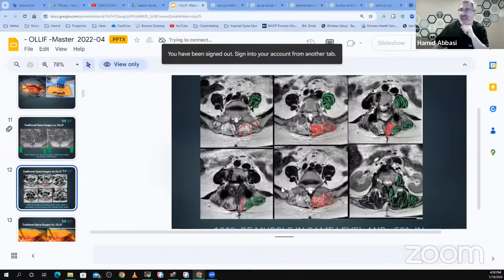And you just mentioned that this is an MRI. But Brittany, you don't notice, but I'm sure she'll notice that this is a wonderful spinal fusion L4-5. In L4-5, the muscle that should look like this, look like that, because that muscle is not muscle anymore, it's scar. But what's interesting, 2 levels above it, this part of the muscle here, we call that multifidus muscle, 2 levels above it is scar, is not muscle anymore.